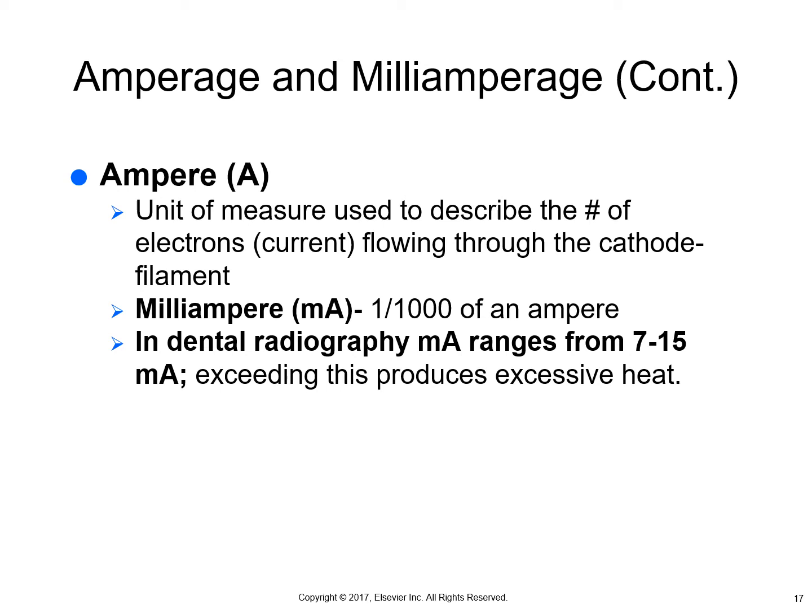And if you ever hear somebody talking about a blown X-ray tube, that's what they're talking about. That little bitty filament, that tungsten wire, will break over time. So that's what they are referring to when they say they have a blown tube.